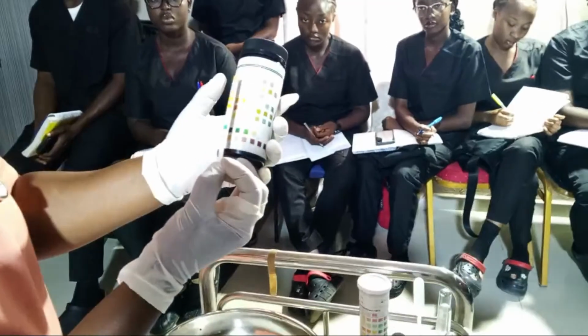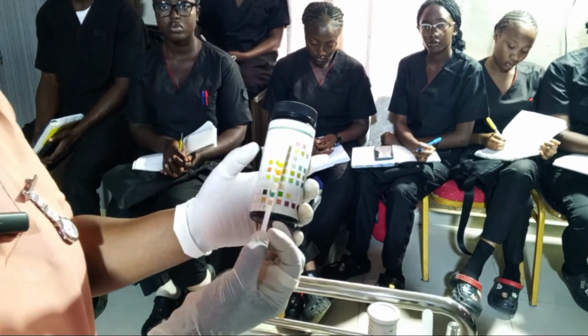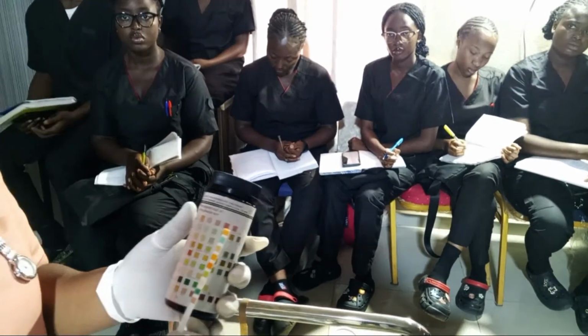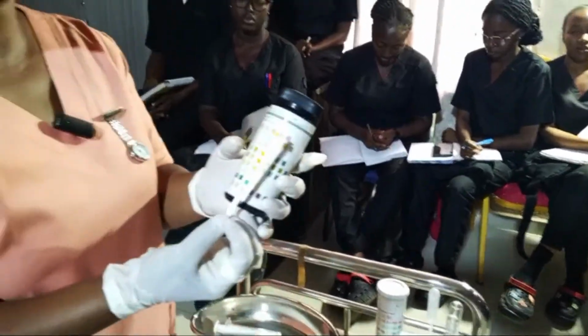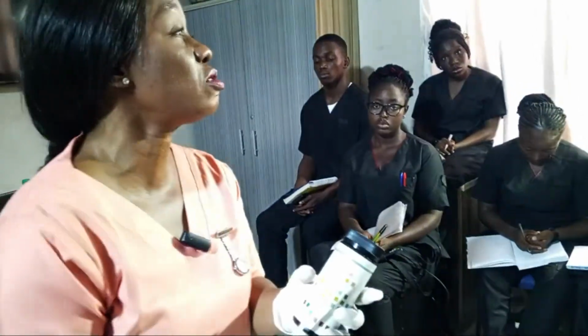It's 30 seconds already. So maybe the instruction says that test for glucose or protein or ketones, isn't it? Maybe that's a diabetic patient, and you need to know the level of the sugar of this diabetic patient, or whether it has ketones or any other chemical that you wanted to test according to the instruction being tested during examination.